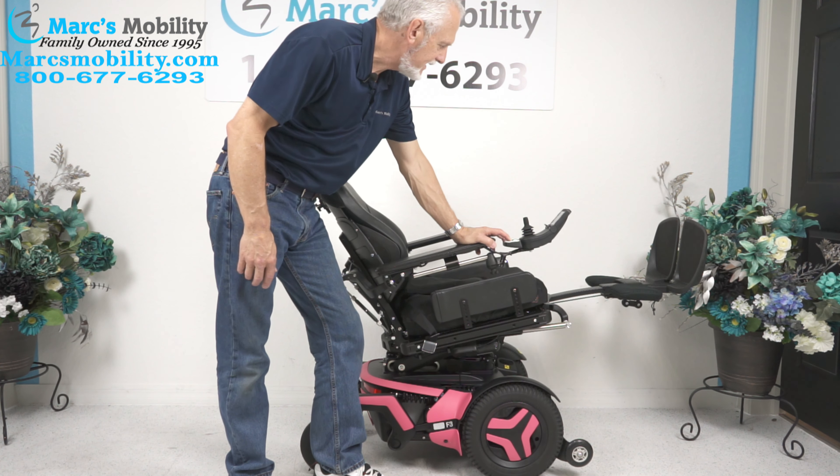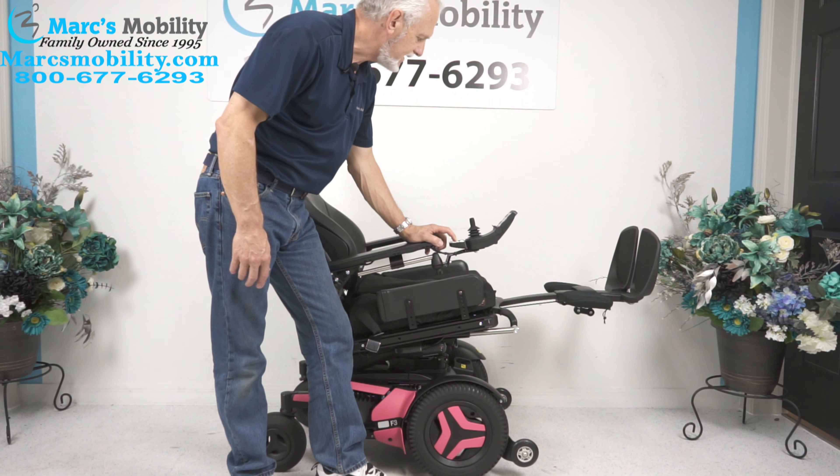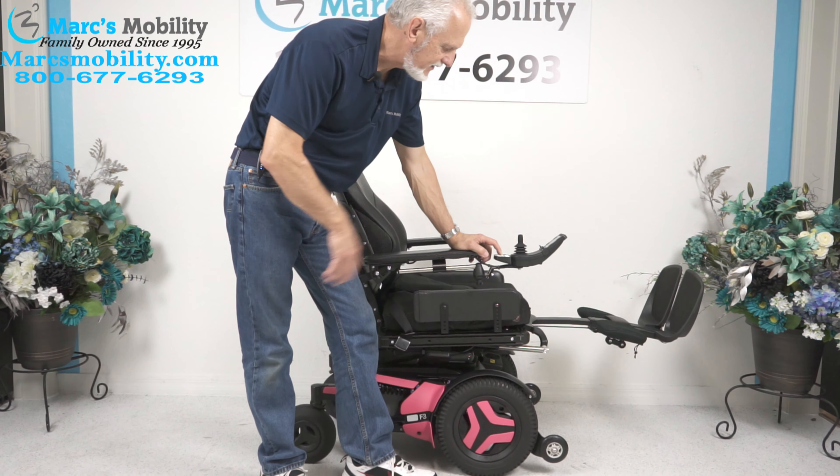I'm going to bring the tilt back down and back the chair up a little bit. I'll leave the legs up for now.